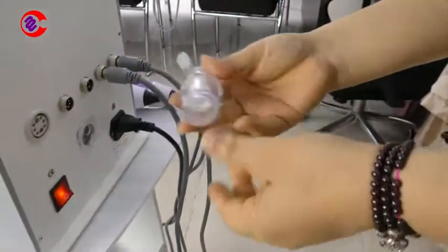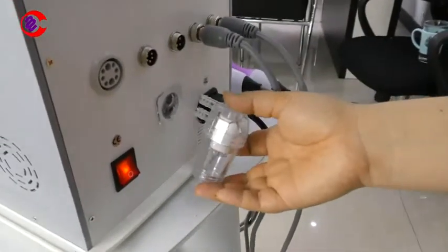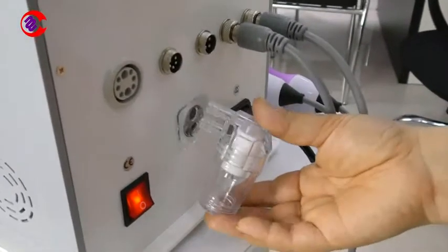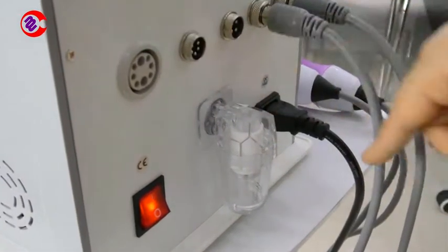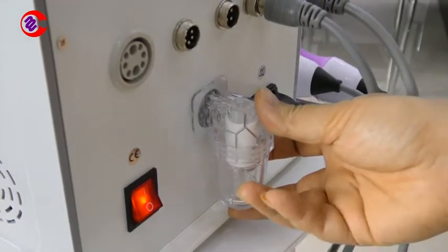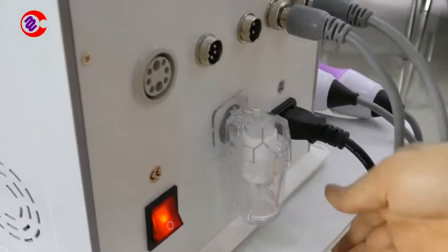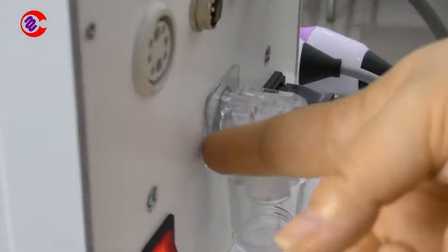Sometimes people will just install this vacuum filter just like this — no, this is an error, it's not right. We should put the vacuum filter like this, close to this base.